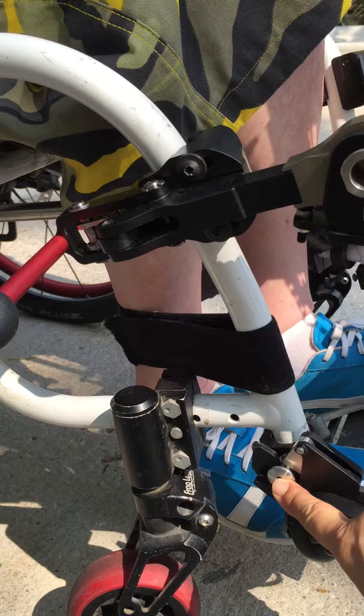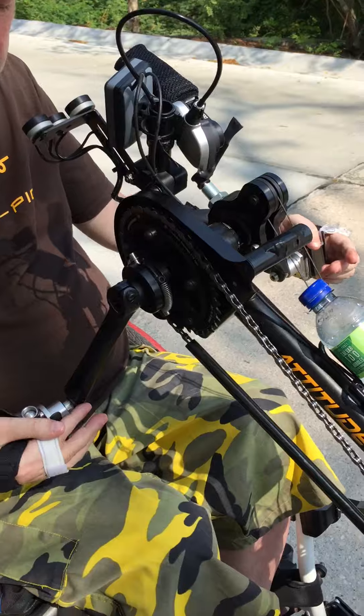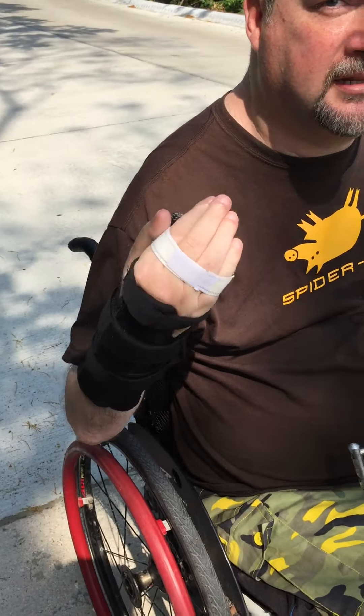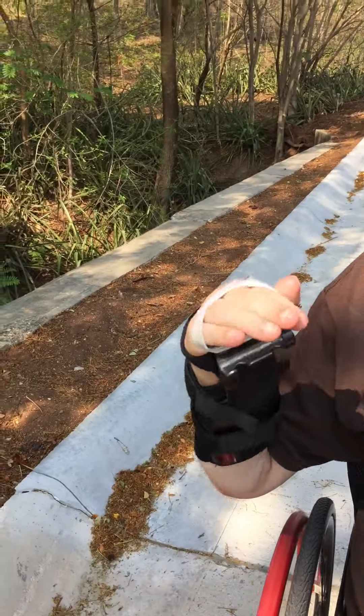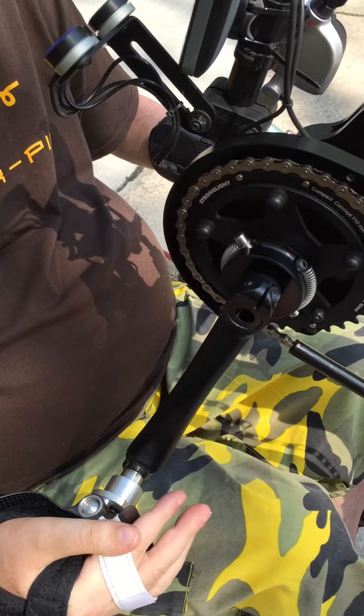Up at the business end here, with my hands which are attached with easy quick release gloves. Pop them in. Dead easy.